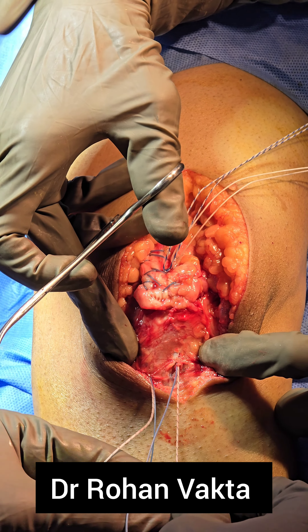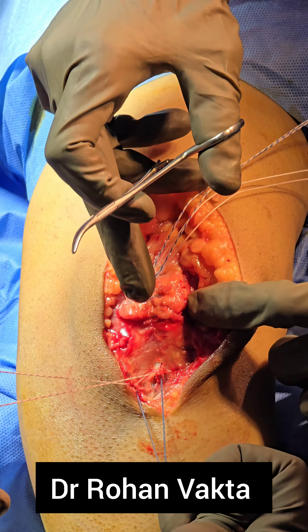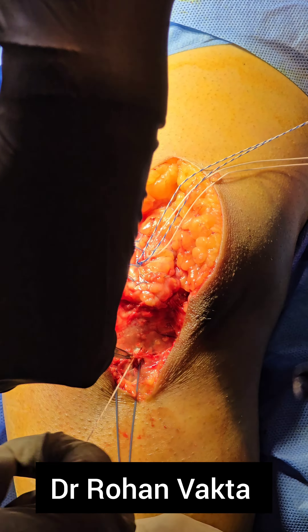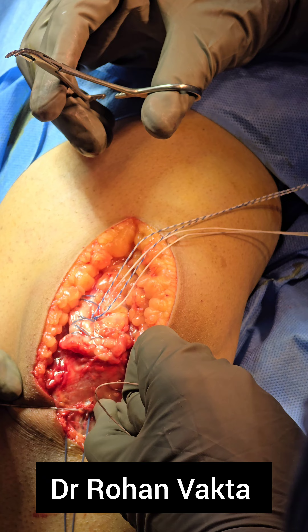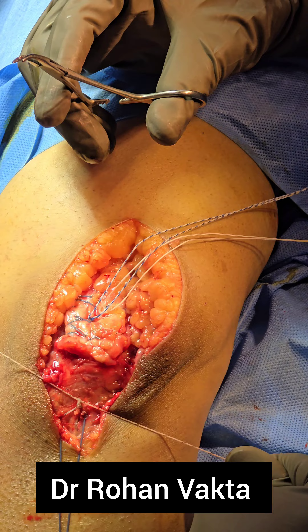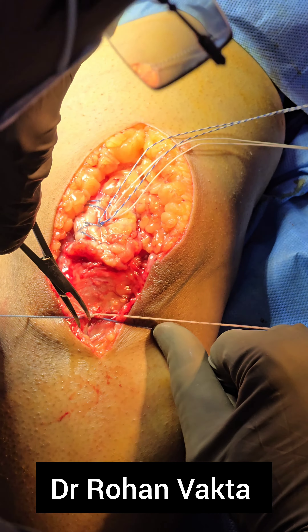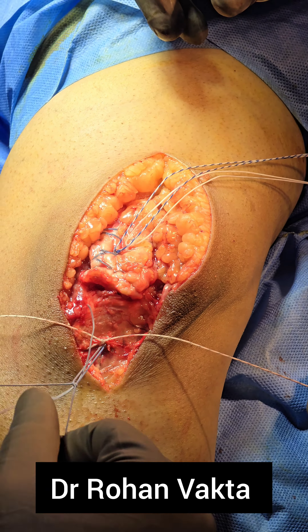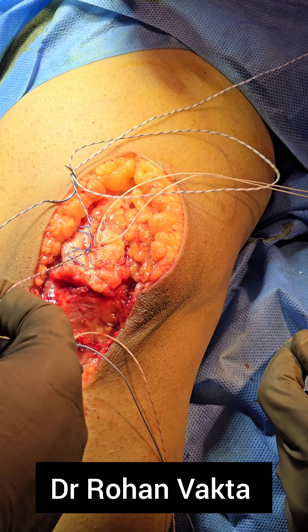To achieve complete reduction of the edges of the triceps tendon, it is very important to perform the transosseous repair. Once the suture anchor fiber wires are tied, the transosseous repair is tightened one by one. There is a bony bridge in between, so there is no need to use an endobutton or suture disc. Once you tie down the transosseous stitches, the edges of the triceps tendon are also well reduced over its footprint. During this tightening, the elbow is kept at around 20 degrees of flexion, as doing it in complete extension risks postoperative flexion stiffness.